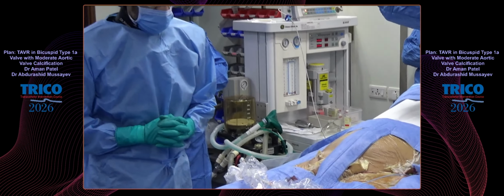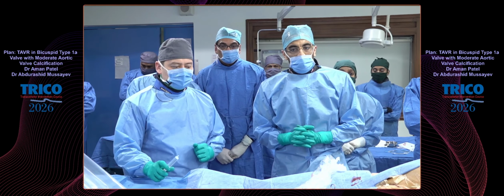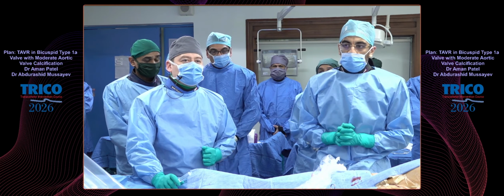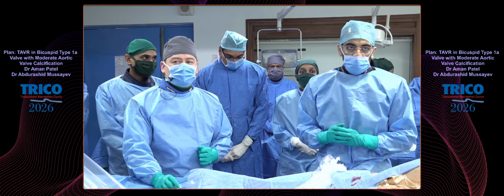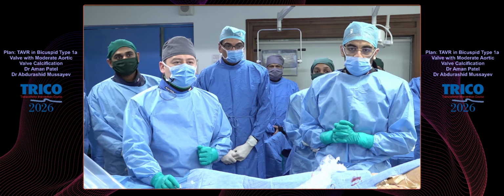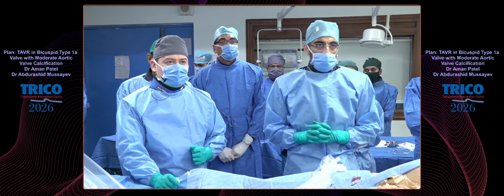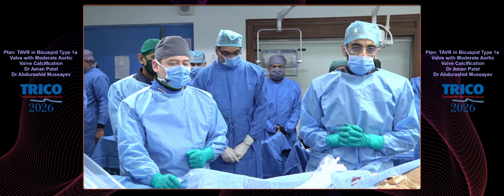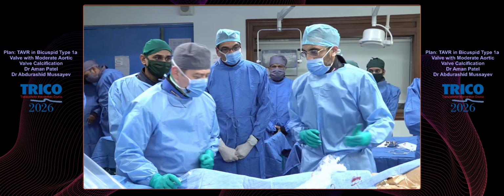Normally in our center we are still not used to doing ultrasound-guided punctures, but Professor Abdurashid only appreciates ultrasound-guided punctures, so he is going to demonstrate it stepwise with the images, how he punctures and how it can help reduce the complications. Dr. Manik Chopra in the panel has also been my mentor and has been a very good support for the last 2 years in developing our program. So let's go to the case, please, sir.